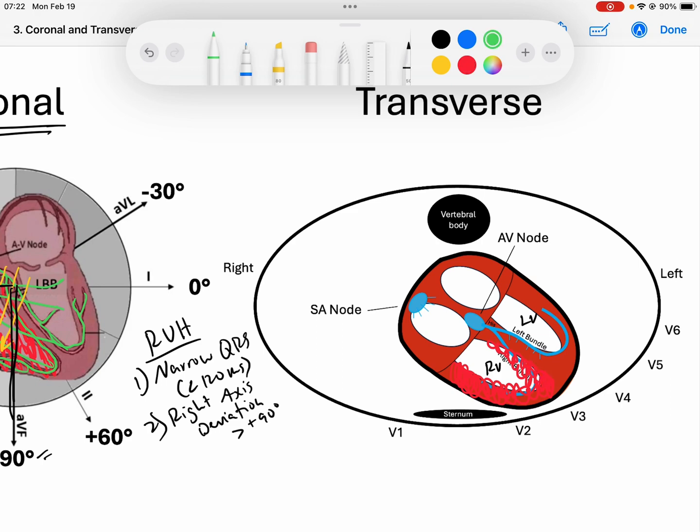Usually the left ventricle draws all the signal, but in this case the right ventricle is going to start drawing signals. Instead of depolarization usually happening towards the apex of the heart, we're going to see depolarization occurring in this direction. It's going to start to bias the right ventricle. The right ventricle is captured really by V1.